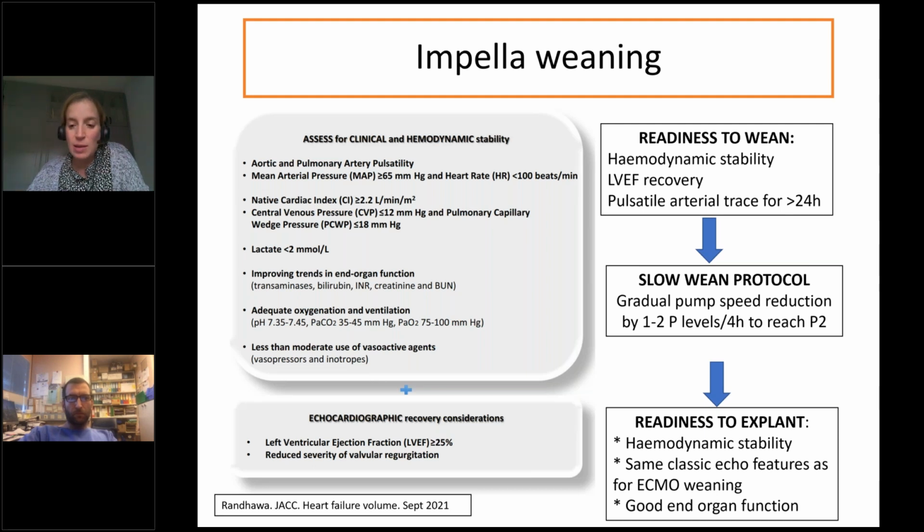There was severe damage to the femoral artery during insertion, which is very rare with Impella nowadays. So then, luckily, we would have weaned from both devices, and a patient can carry on their journey.